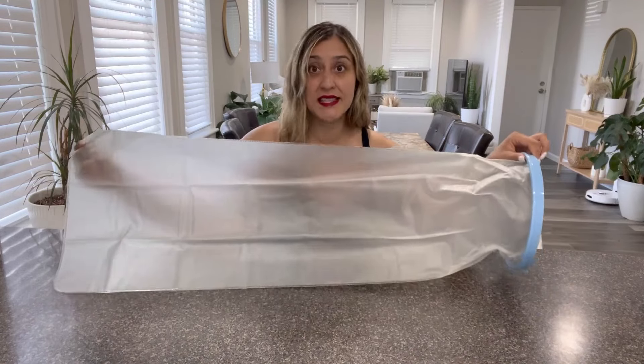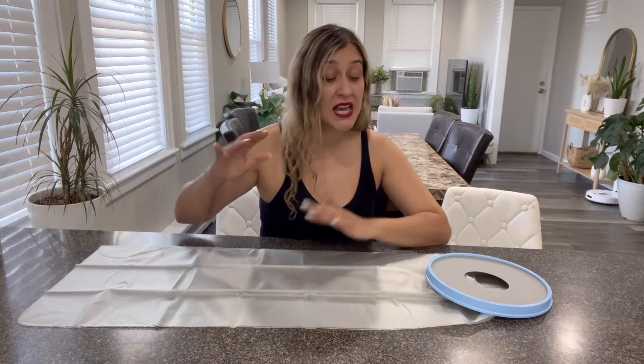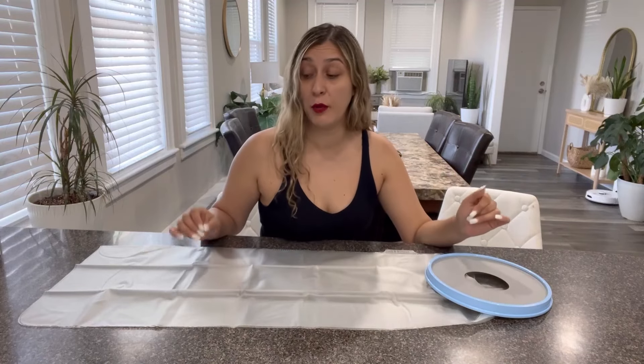The size is extra large. This product is suitable for people between 5'5" and 6'4" in height and between 100 and 300 pounds in weight.